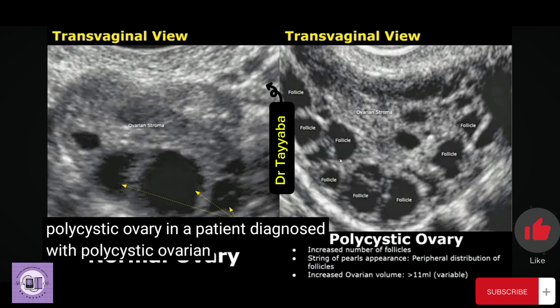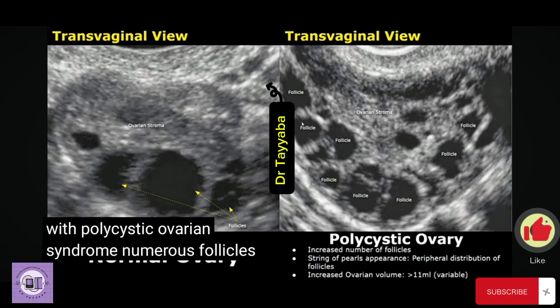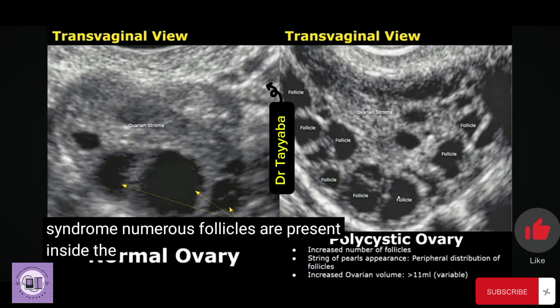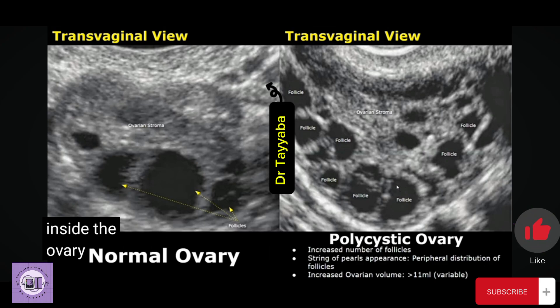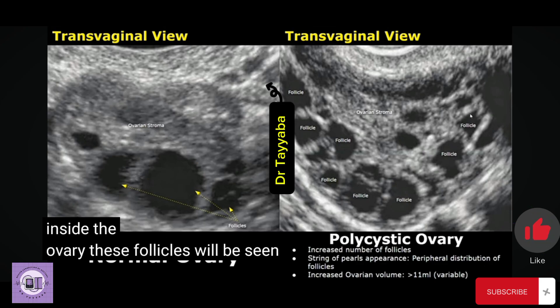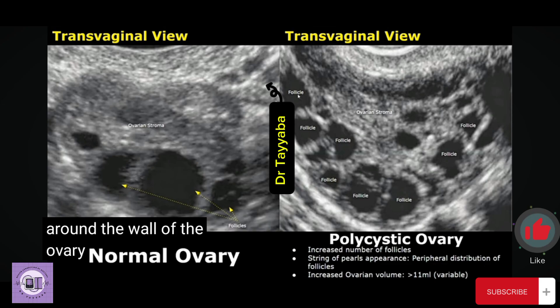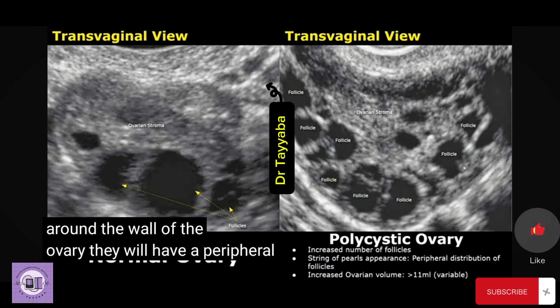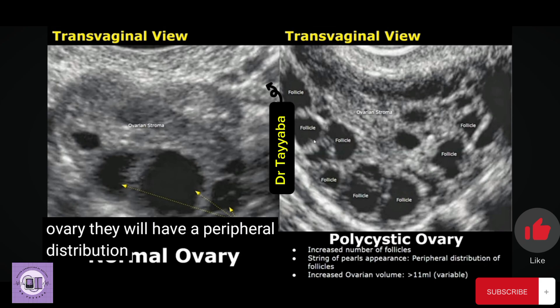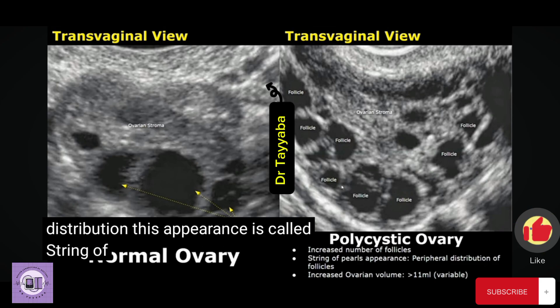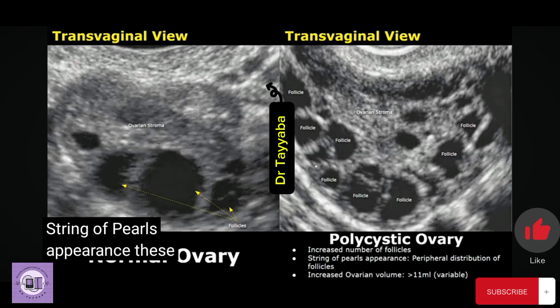The image on the right is of a polycystic ovary in a patient diagnosed with polycystic ovary syndrome. Numerous follicles are present inside the ovary. These follicles are seen around the wall of the ovary in a peripheral distribution. This appearance is called the string of pearls sign.